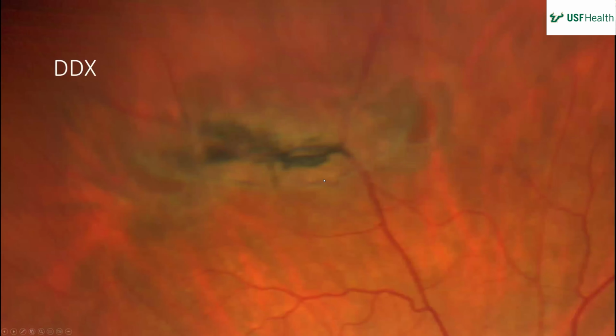So what's your differential? Certainly a retinal tear causing these acute onset floaters and flashes. The fact that there are some sclerotic vessels and some pallor makes me think about an old BRAO that might have happened and made that area prone to a tear developing. And then the pigmentation suggests a chronic nature to it, so something might have happened in the past.